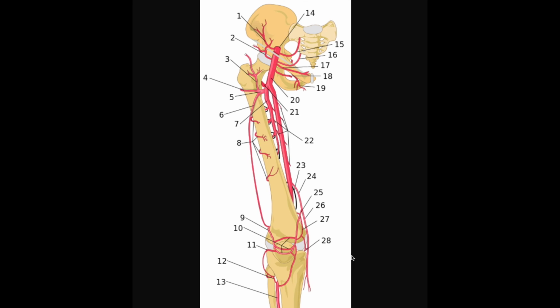Sometimes we can have pseudoaneurysms that arise here when a patient had a procedure, but there's not enough closure of that artery, or there's a small injury, a small hematoma that accumulates. You can have a pseudoaneurysm, which is an outpouching of this artery, and we have several treatment options for pseudoaneurysm, but I just wanted to mention a common one is thrombin injection under ultrasound guidance of a pseudoaneurysm.